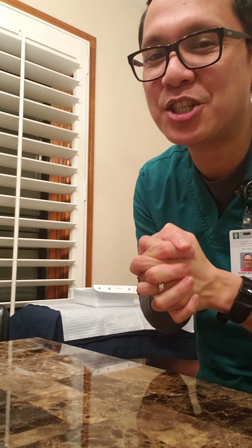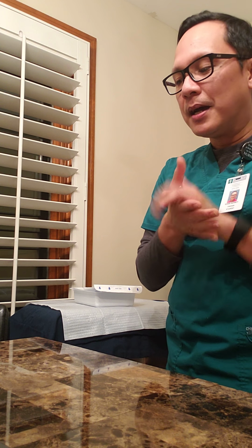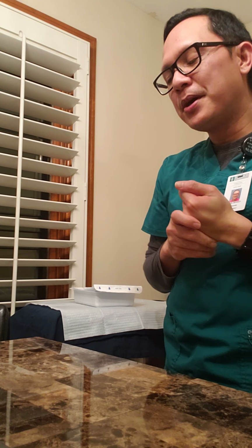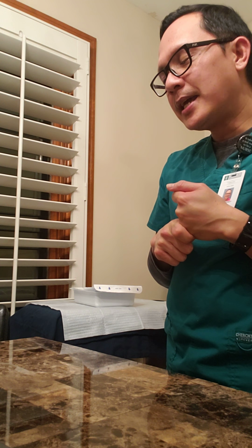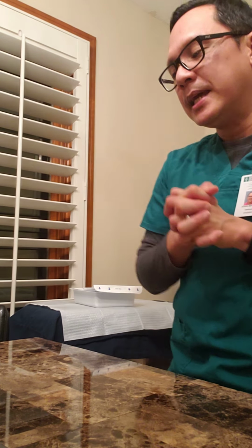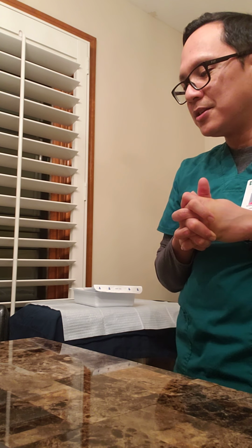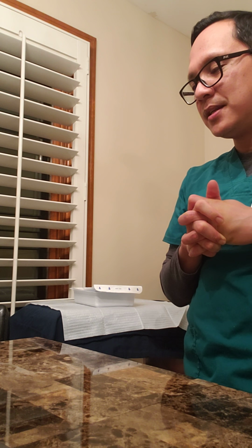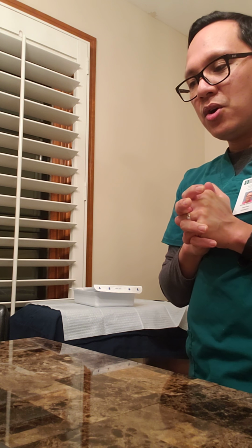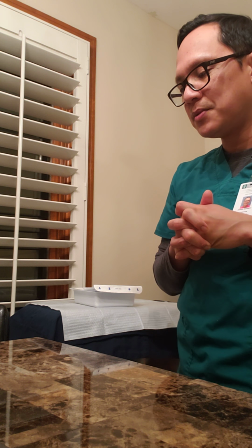I want to make sure I confirm my patient by looking at the chart and the order and asking my patient for two identifiers. Sir, can you tell me your name and your date of birth, please? Okay, Mr. Smith, thank you very much. Can I ask if you have any allergies that you know of, like any allergies to any medication, any cleaning solution, or latex? Or any environmental allergies as well? No? Okay, thank you very much, sir.